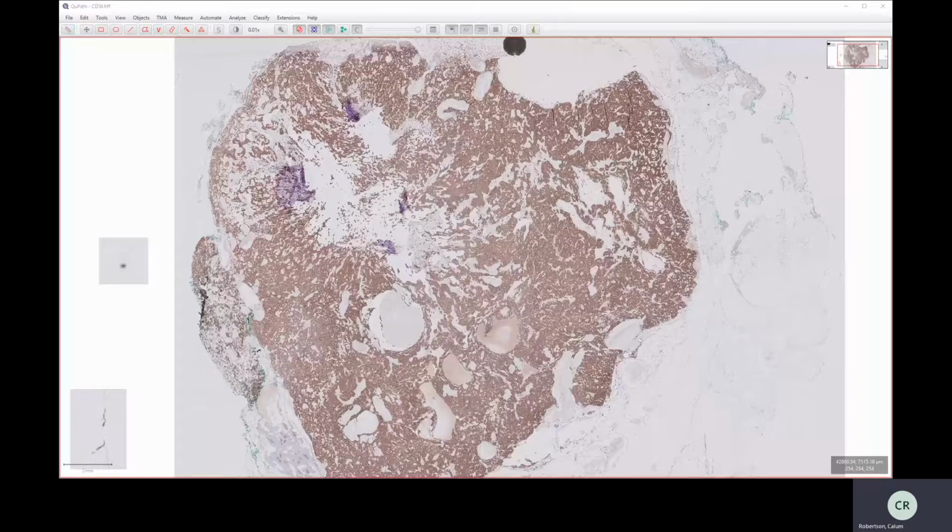We also use histochemistry without immuno, also known as special stains, in a variety of settings. But IHC is what I'm going to talk about in this video, and that forms the majority of the adjunct tests that we use, and they're used very commonly in routine diagnostic practices.